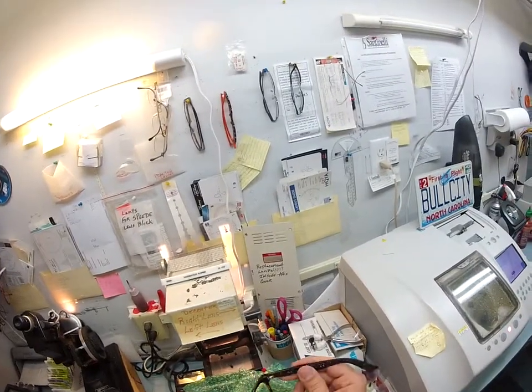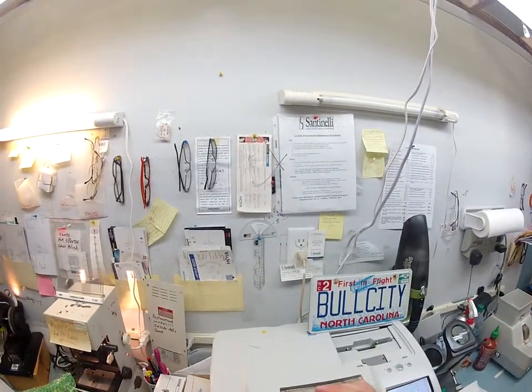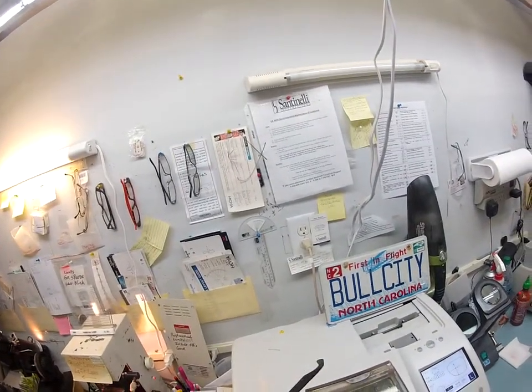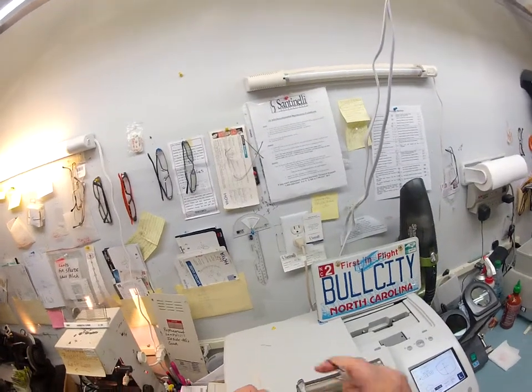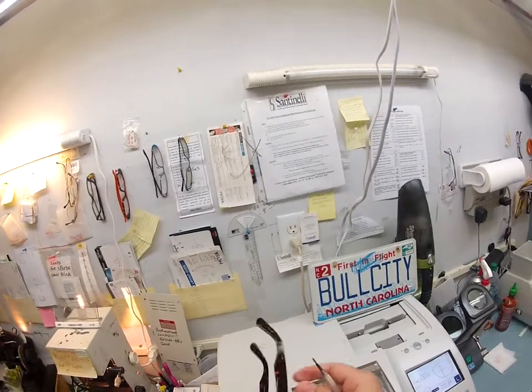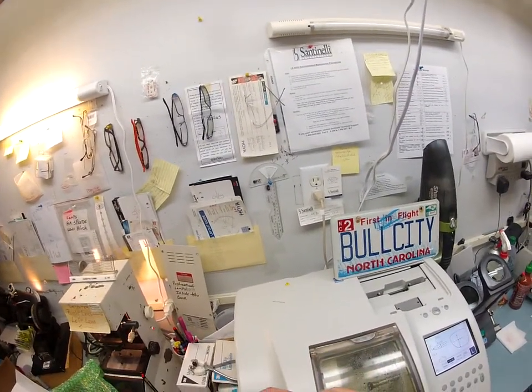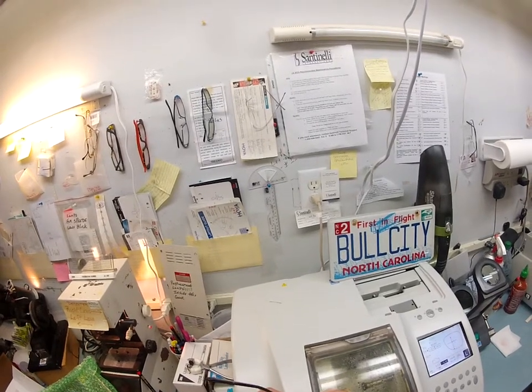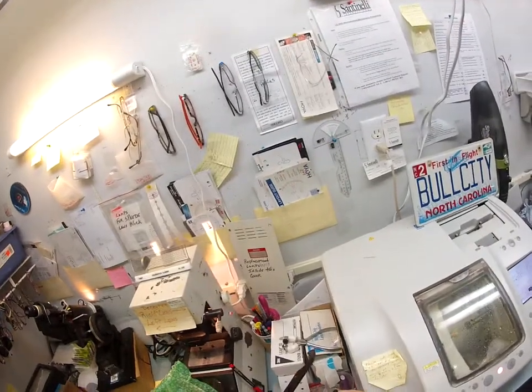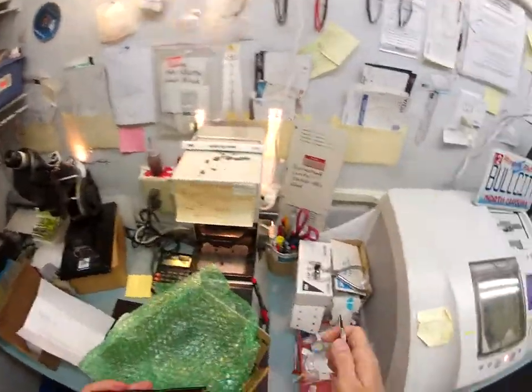First things first, I don't like how tight your hinges are. I'm going to loosen this, because these are so tight it puts torque on the bridge of the frame. I'm going to loosen this hinge just a little bit, just so that your glasses will last a very long time. The worst thing you can do with a pair of glasses is over-tighten this hinge screw right there.